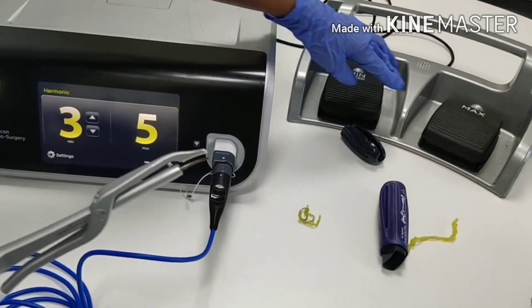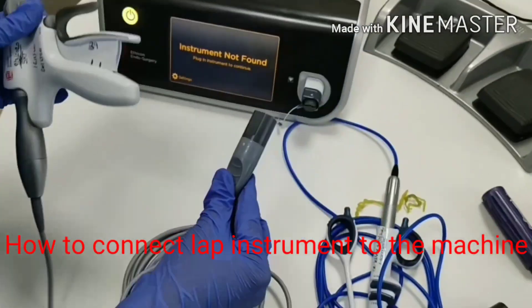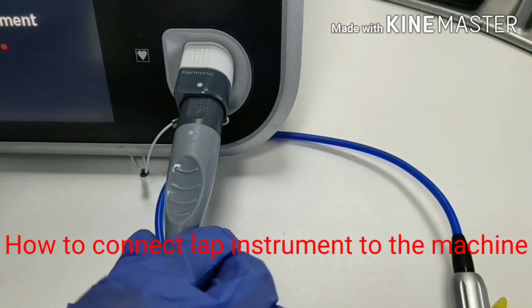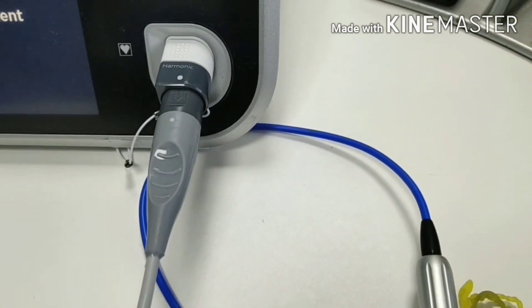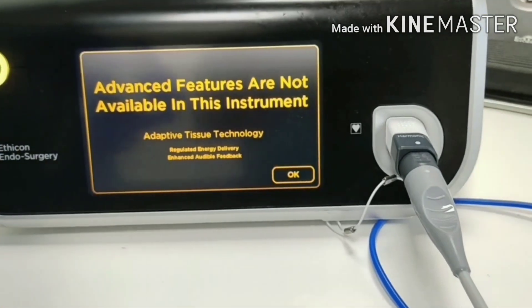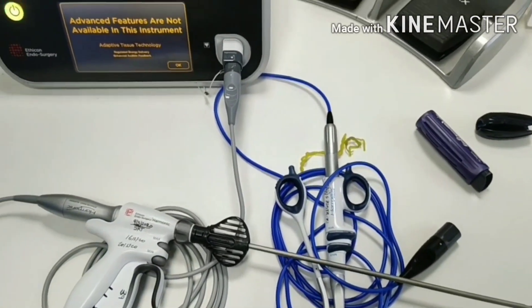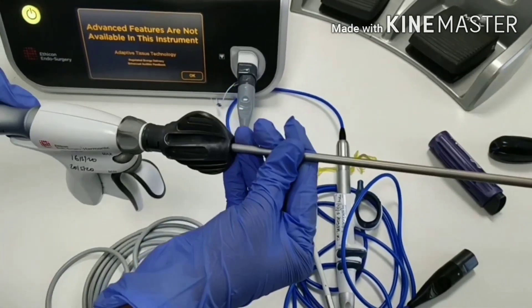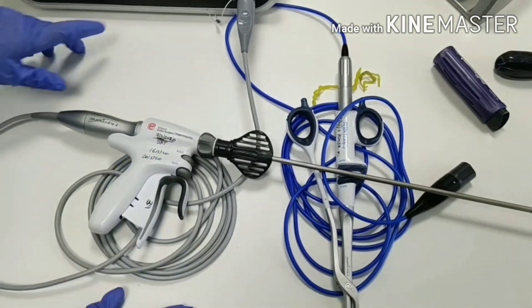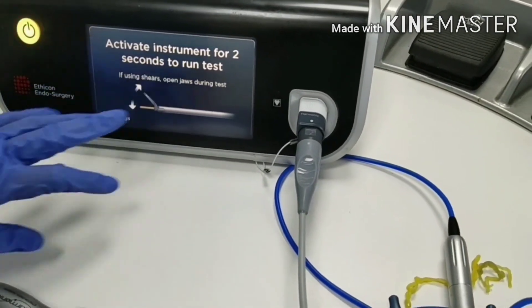This is the minimum key and this is the maximum key. To connect the laparoscopy probe: same connection — white dot here and white dot here, match the dots and insert the connector. The machine is showing that advanced features are not available in this instrument — this is a simple probe. JNJ Company has lots of technology in probes like Ace Plus probe and Ace Sharp probe. This is the basic probe. Press OK and go ahead.